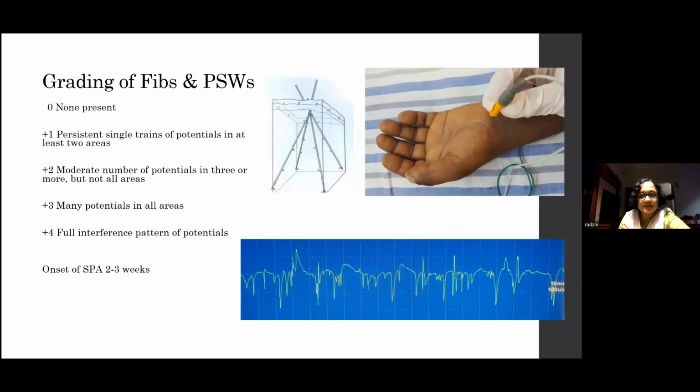But in GBS, for example, acute neuropathies like that, the persistent denervation that you see even after 4 weeks doesn't really mean that the GBS is ongoing. It just means that the patient has been affected so badly, the axonal loss is so bad, that there is still persistent active denervation and the muscle fibers are still not reinnervated. That's all it means. It doesn't mean that it's active, so the GBS is continuing beyond 4 weeks and we need to treat. So we just need to make that distinction.